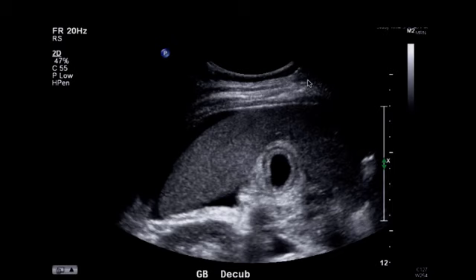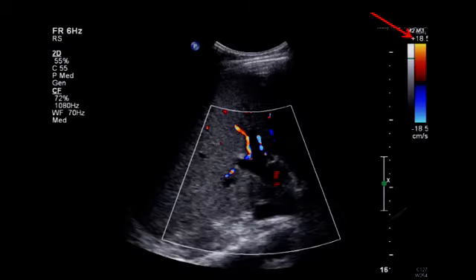And we looked at his gallbladder, again, diffuse wall thickening. We turn on the color Doppler, it looked like he had portal vein thrombosis. Here in the main portal vein, there's absolutely no signal in the portal vein, and we have nice signals coming from the hepatic arteries. But the important thing to recognize is that patients with this syndrome don't just suddenly reverse flow or develop thrombosis, the flow slows down.